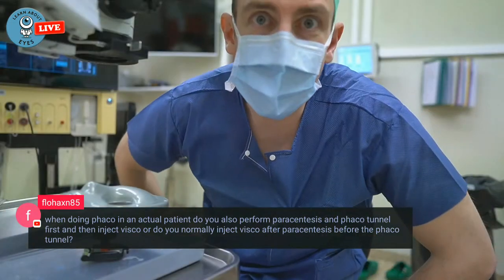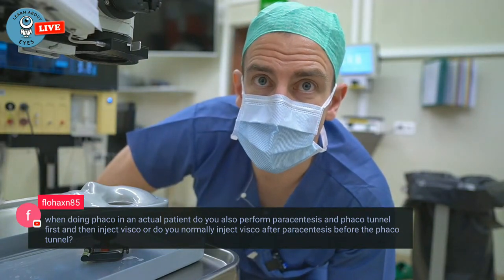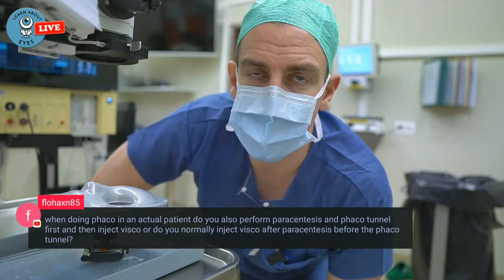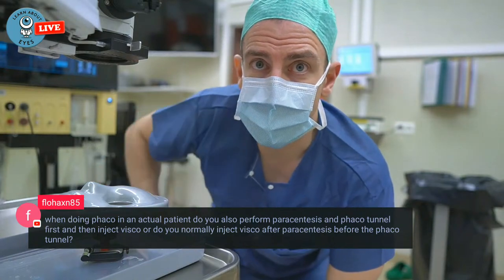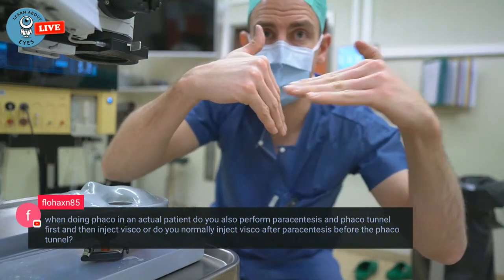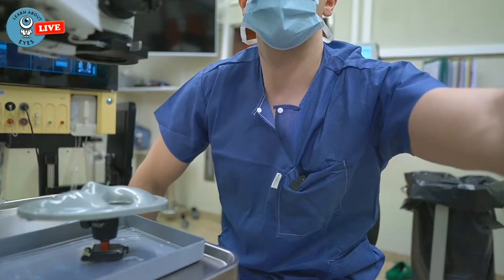Let me just quickly answer that question to Flo. Yes, this is what I do. I do two paracentesis, one incision in this order, and then I do the Visco. I don't like doing my incisions while having Visco in the anterior chamber, because they tend to get too short because it's bulged up and you're just kind of 90 degreeing into that. And I've just gotten used to that technique. So no, I do it exactly as I showed it before, yeah.